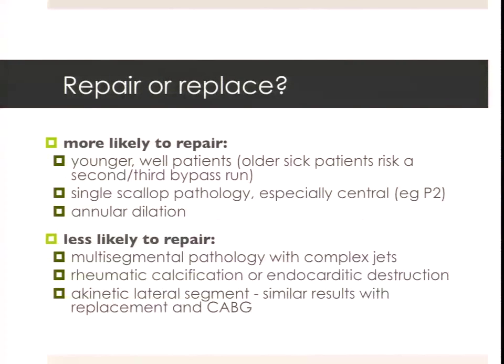Single scallop pathology is obviously easiest for the surgeons to repair. Annular dilatation is an easier problem to address. Multi-segmental pathology, you've heard some of the surgeons here already talk about how that can be very difficult to repair.